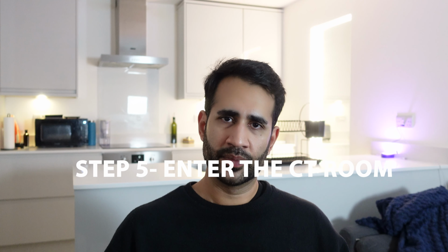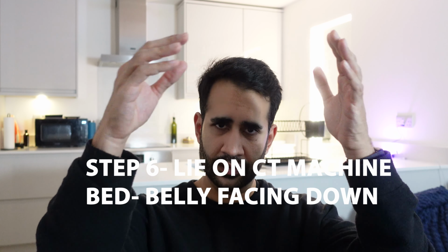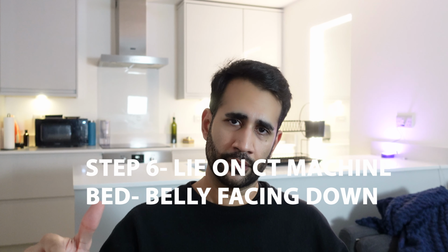So then next, you'll be taken into the CT room. So the procedure is done under imaging guidance, and in this case, most of the time it will be done under CT. So you'll be taken into the CT room, which is like any kind of clinical or hospital type of room, usually lino floored, and then obviously the CT scanner in the center of the room. And then the first step will be to get you onto the table. So you've got the big donut, and then you've got the bed in the middle of the donut.